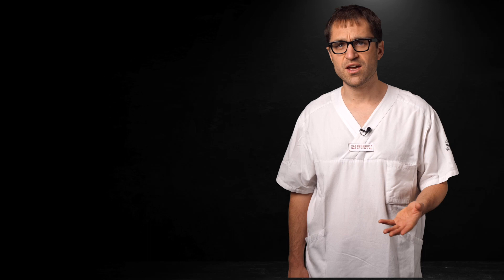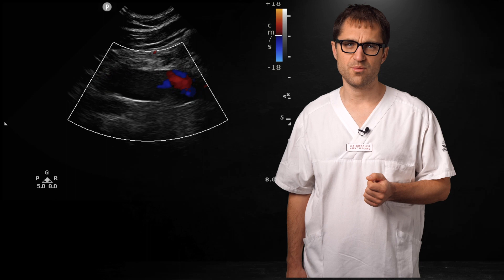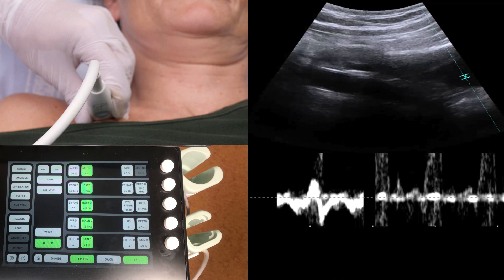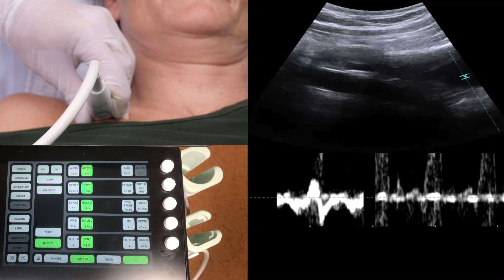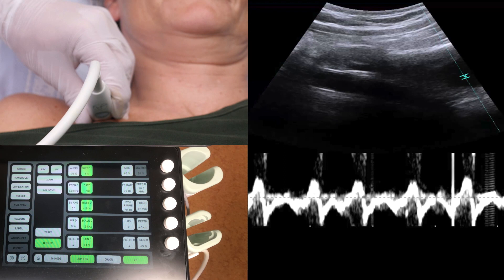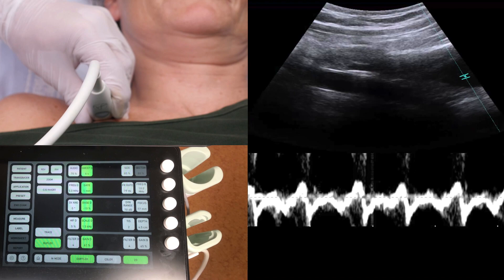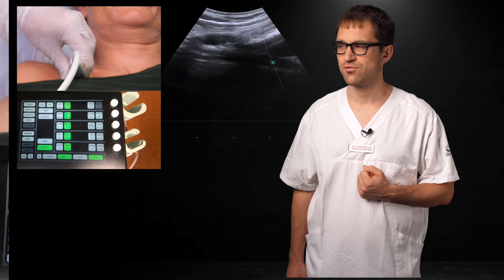There's no room for a shadow of a doubt that you've identified the vein. You can positively identify the vein with color Doppler by placing the vessel you believe to be the vein in the color field and then firmly compressing the patient's arm. The surge of pooled blood that is squeezed up appears as a flash half a second later. Pulse wave Doppler can also be a powerful tool — place the cursor in the middle of what you assume is the vein, which is confirmed by a sloshy sound, then compare it to the more aggressive pulsatile sound of the artery.